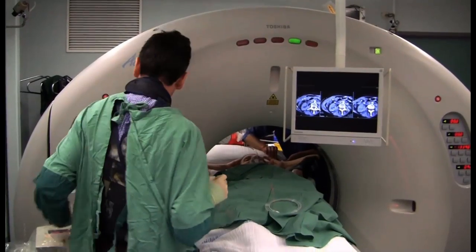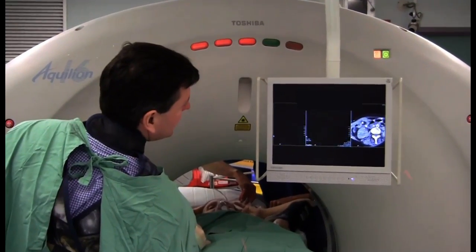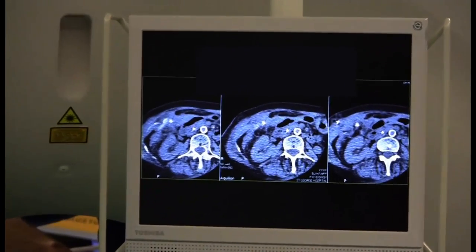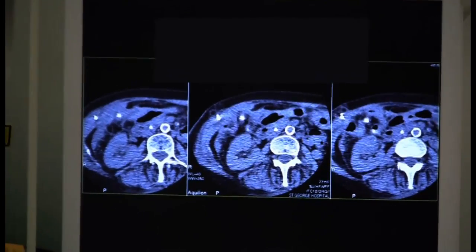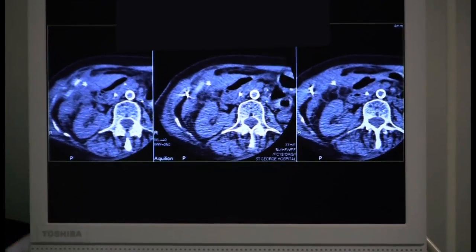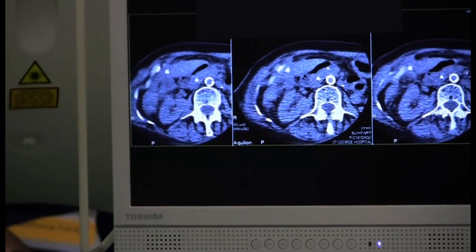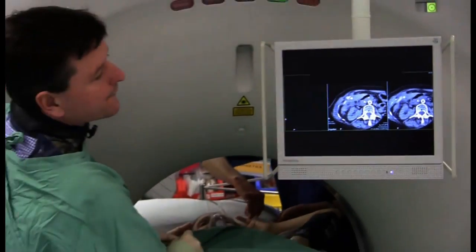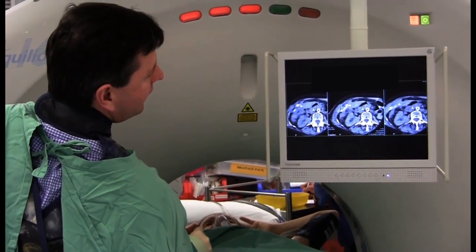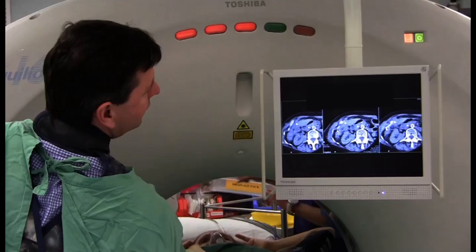We're now angling in from below. We've put local anaesthetic in here and we're giving a little bit of extra fentanyl. Screening now as we go, and we can see the needle start to appear. We know where the inferior extent of the collection is, so we're just moving the needle tip and pulling the patient back. Just on top of the collection at that point — and we're in.